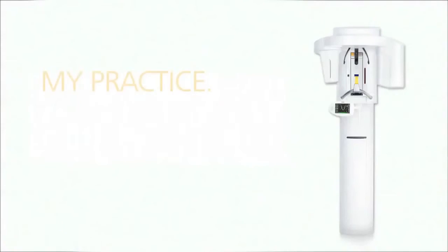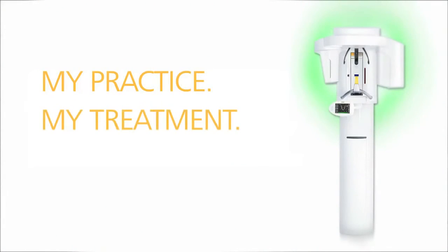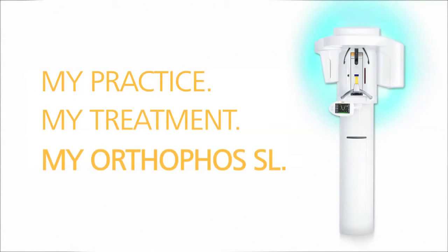My practice, my treatment, my Orthophos SL.